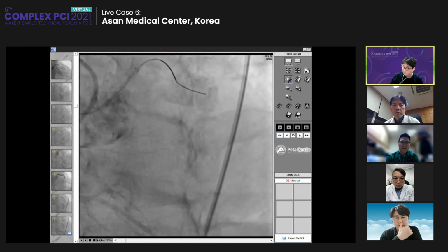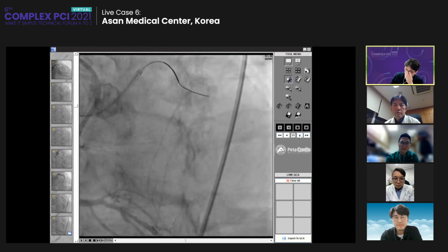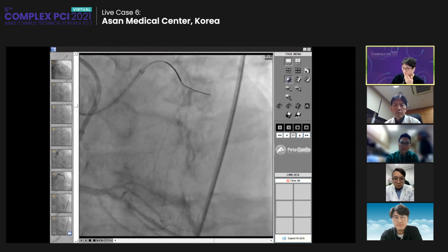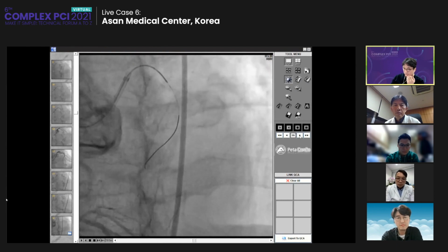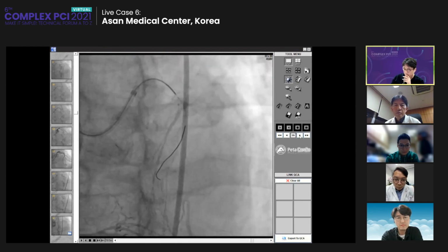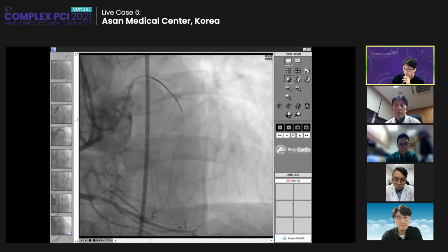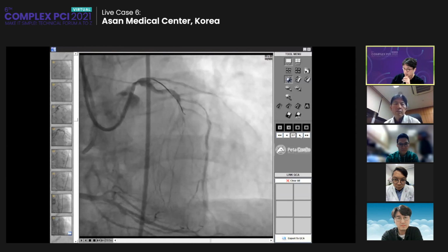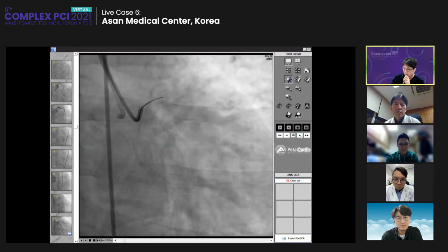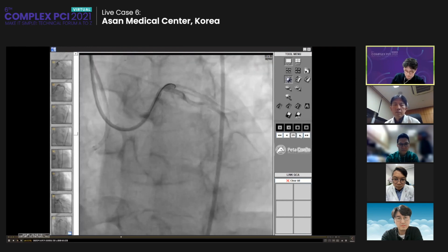You can see that through the right angiogram, the wire from the left is located elsewhere. I don't know where it is, but it's somewhere else. And you can see it failed to go through the true lumen. This was the failure course of this previous session.